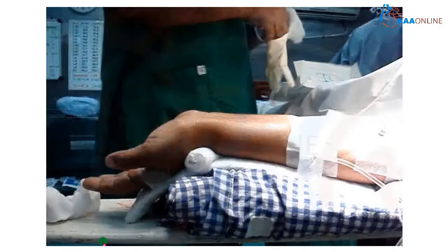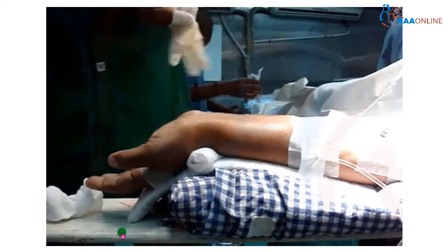Coming to the technique of radial artery cannulation by the direct method, the first thing is positioning. You have a splint below, and you have placed a lower pad below the wrist crease so that the radial artery becomes prominent. Dorsiflexion is very, very important. This is the positioning.